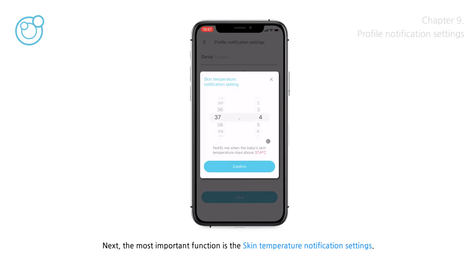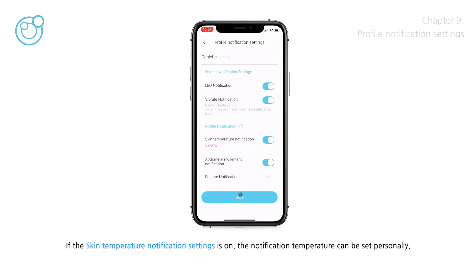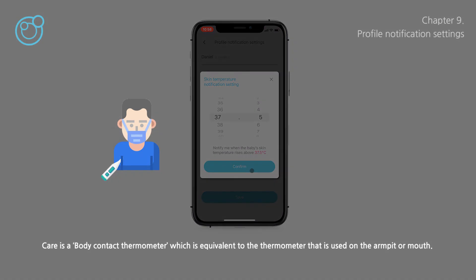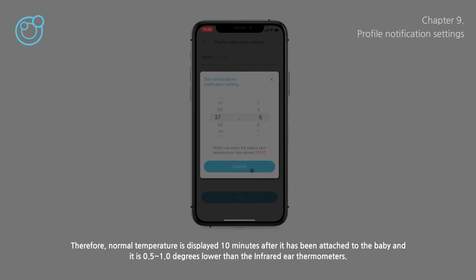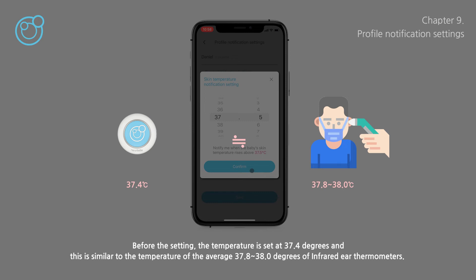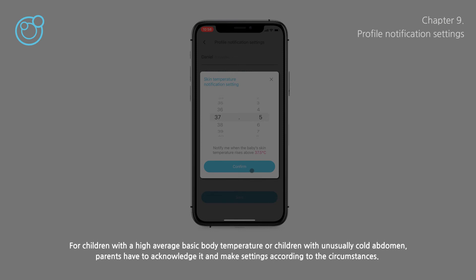The most important function is the skin temperature notification settings. If the skin temperature notification is on, the notification temperature can be set personally — a notification is triggered when the baby's temperature exceeds the set value. Care is a body contact thermometer equivalent to an armpit or mouth thermometer, so normal temperature is displayed 10 minutes after attachment and is 0.5–1.0 degrees lower than infrared ear thermometers. The default setting is 37.4°C, similar to the average 37.8–38.0°C of infrared ear thermometers. However, for children with a high average body temperature or an unusually cold abdomen, parents must acknowledge this and adjust settings accordingly.